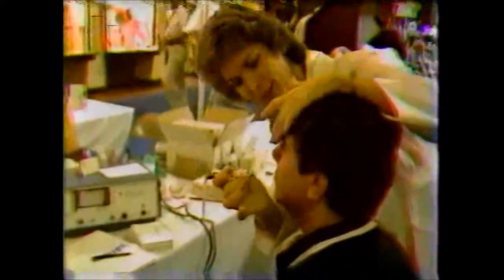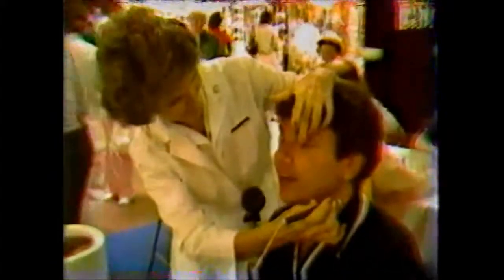All righty. Real good. Now, stare with the right eye, because I'm going to get in front of you a little bit. Keep that right eye open and stare. We got to regroup. Okay, now you're going to stare, and I'm going to hold you a little bit better, but you got to open that right eye. It controls that left with me getting in front of it. It's hard, okay? You got to kind of psych yourself up to do it. Psych myself up for that.